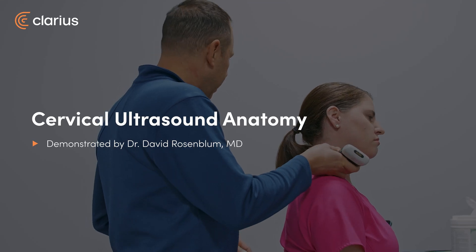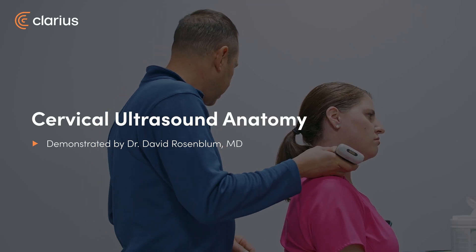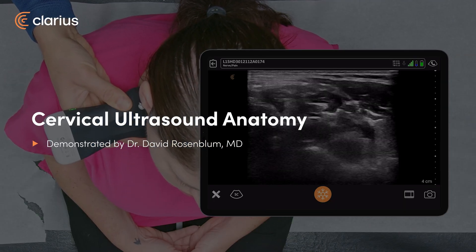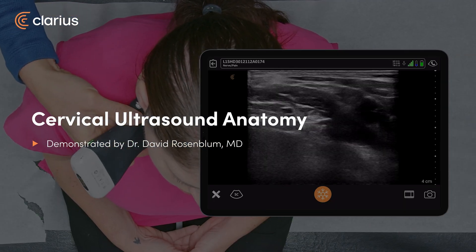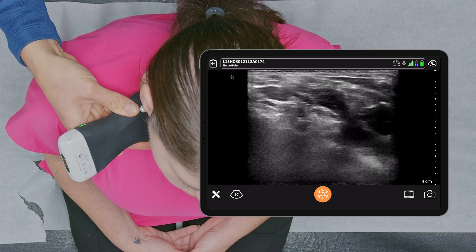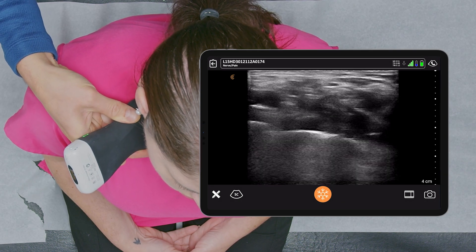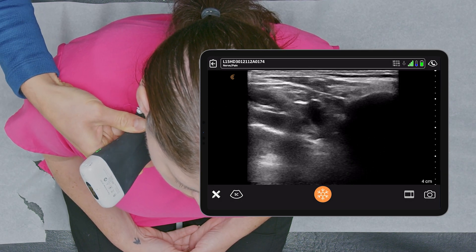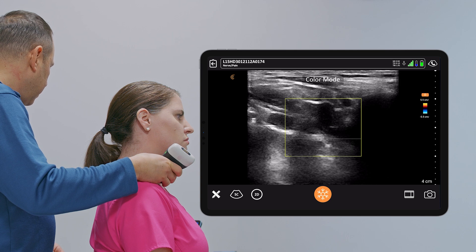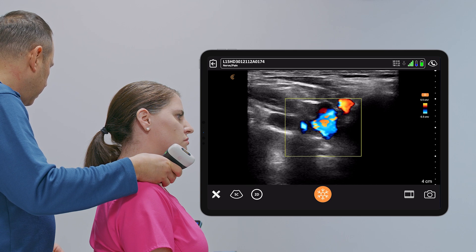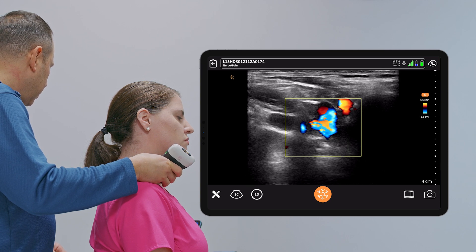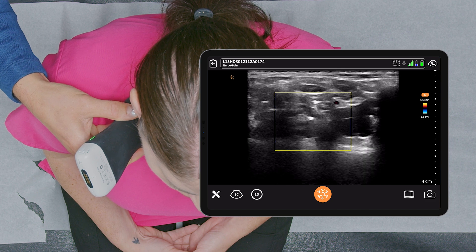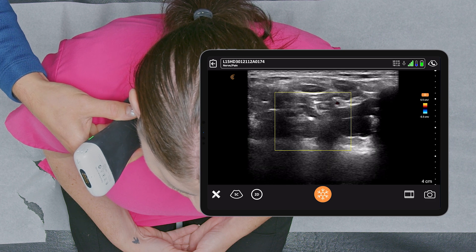We're first going to scan Sarah's neck. As I usually advocate, I look for the brachial plexus in the supraclavicular fossa. I find the subclavian artery and the nerves. Here's the subclavian artery, and the nerves are above it.